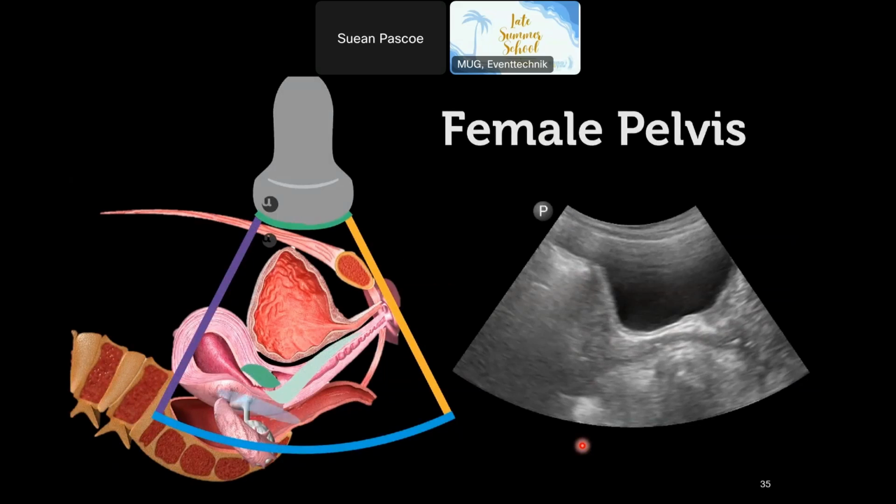or even angle up slightly so that we can see we've got bladder, then the short bit of the cervix and the vagina makes like a Nike tick, or you've got like the uterus and the vagina making an arrow, and the free fluid sits posteriorly. So here we have bladder, uterus, vagina, and we need to look here for the free fluid.